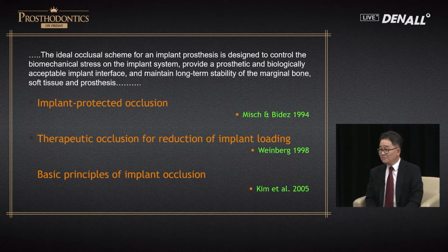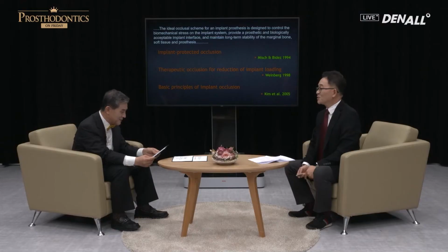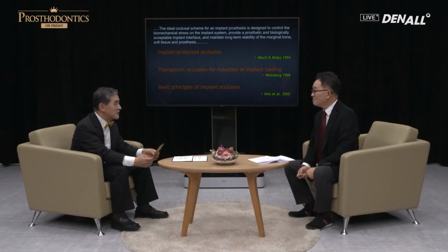May I cut in and ask a question? Of course, Professor Cho. Many clinical researchers say that, compared to a natural tooth, to protect the implant, vertical and lateral force need to be reduced. In order to do so, how do you implement that in a clinical setting?